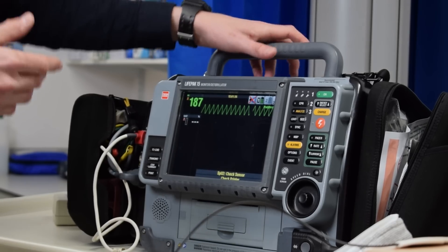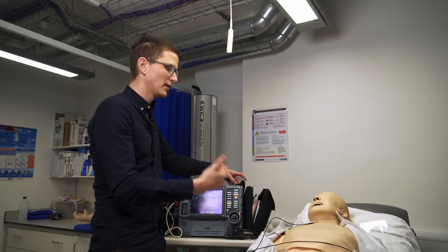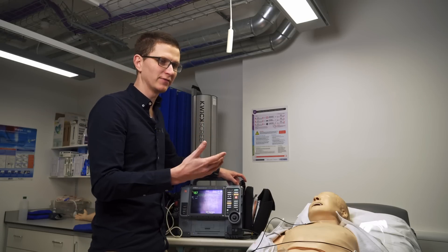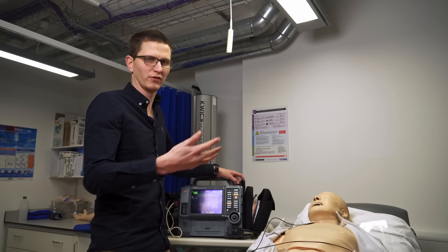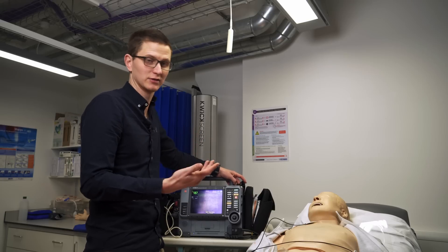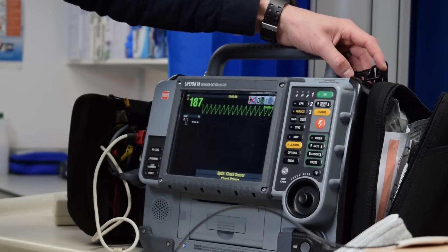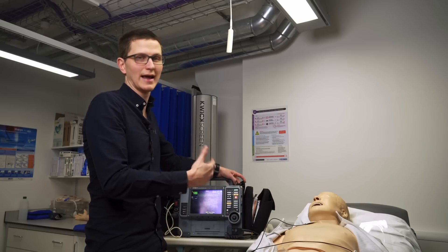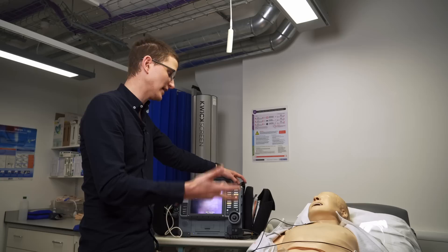The important bit about cardioversion is that yes, it's going to hurt. I spoke to a patient who I cardioverted and he said it's painful, but by the time the pain has come, the pain has gone, and he's just grateful that he no longer has that shortness of breath, chest pain, and decreased level of consciousness. We can give something for pain — something like midazolam — but that can drop blood pressure, so we don't delay treatment for sedation if the patient is crashing.